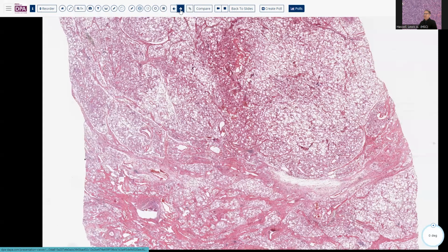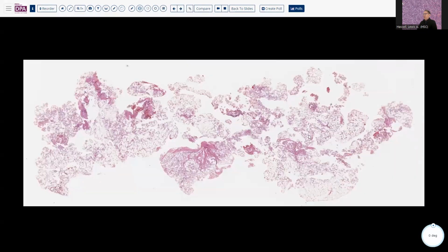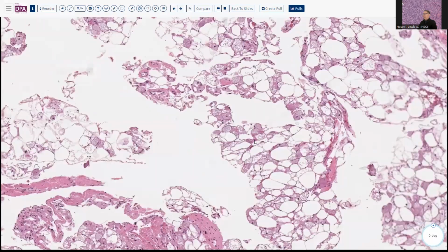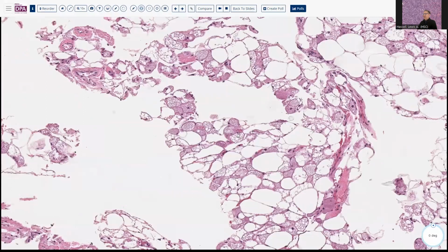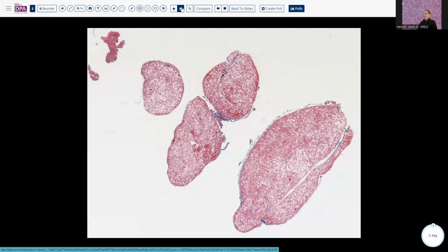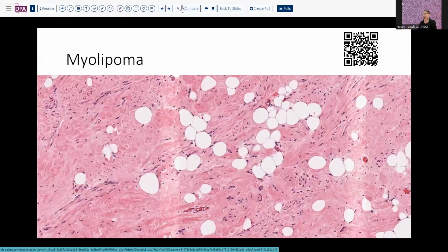But if you're careful and look at it, you should be able to distinguish these brown fat cells from histiocytes with foamy debris. So here's one with relatively little brown fat tissue, a higher proportion of the typical adipocytes. And here you can see why these would be different from typical foamy histiocytes, even though they both will have fairly central nuclei and this sort of lacy cytoplasm. Well, we'll skip this one. You've probably seen enough of this lesion already, but you can come back and look at it at your leisure.